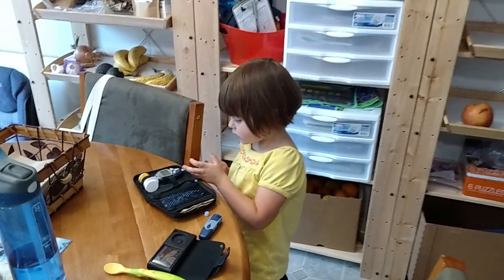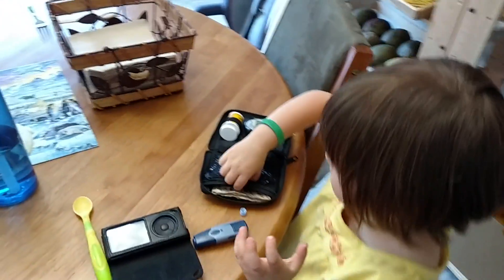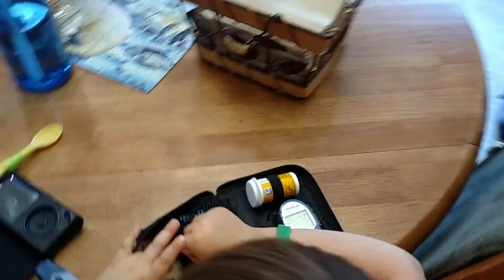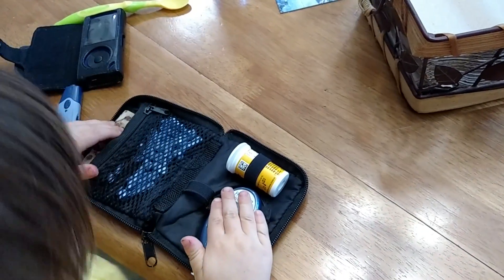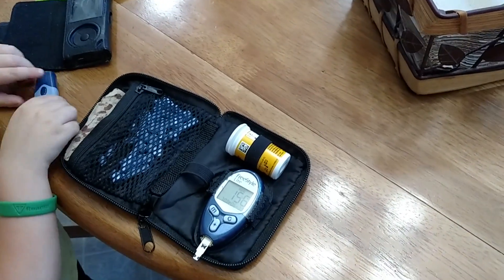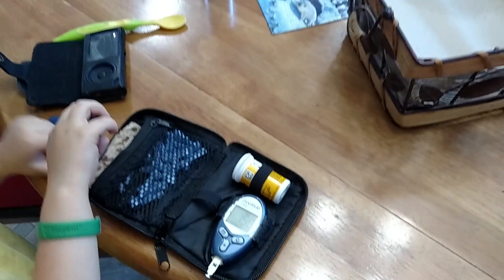So she's testing her blood now. She's putting it into her meter. And let's see — what is your blood sugar? Don't look, okay? Let me show the camera. My blood sugar is 156.